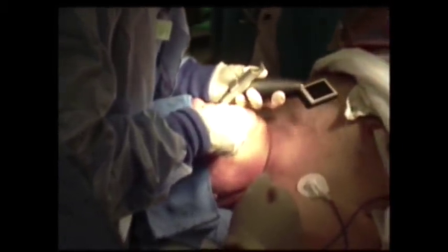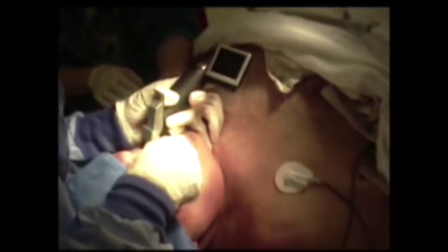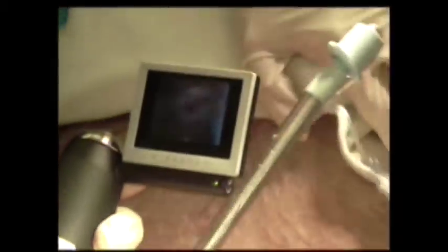Do you have it on? Yeah, okay, here we go. There we are — got the cords. There we are. Look at that — great picture. The image quality on the LCD display is clearly visible during the live intubation.